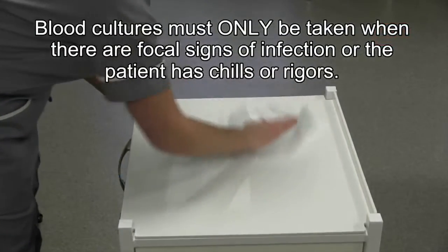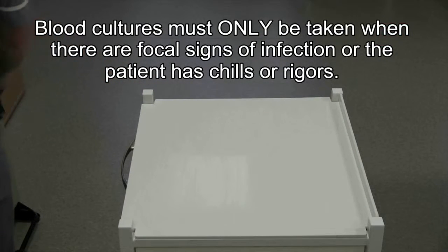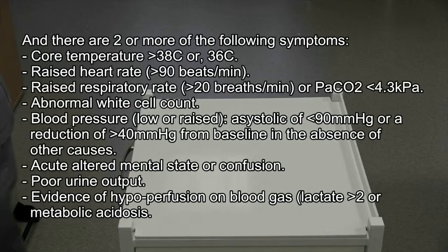Remember, blood cultures must only be taken when clinically indicated and only done so by competent and assessed members of staff.